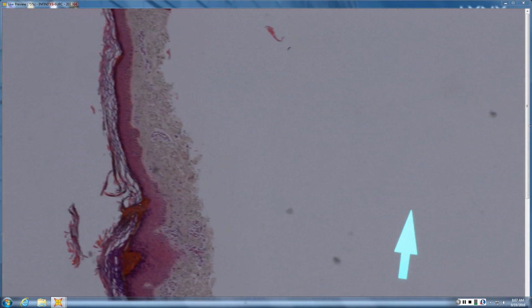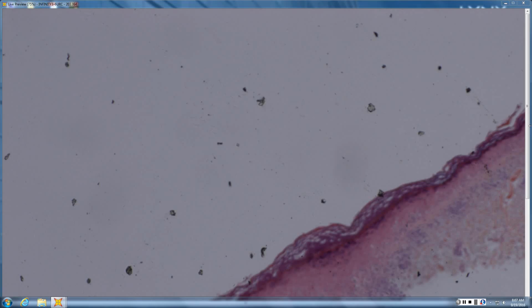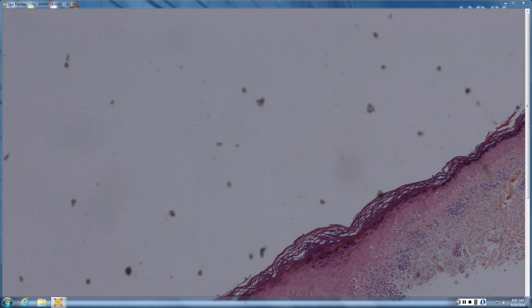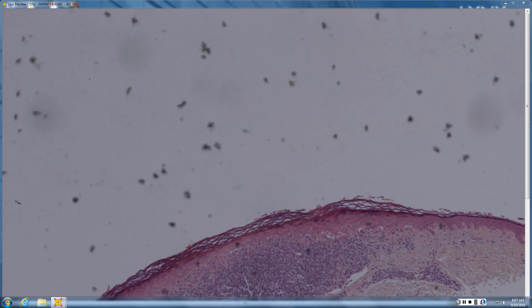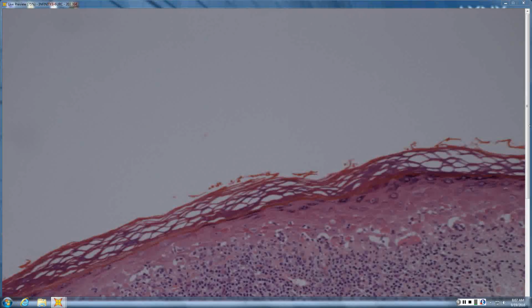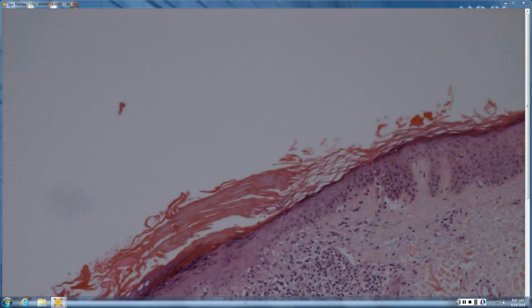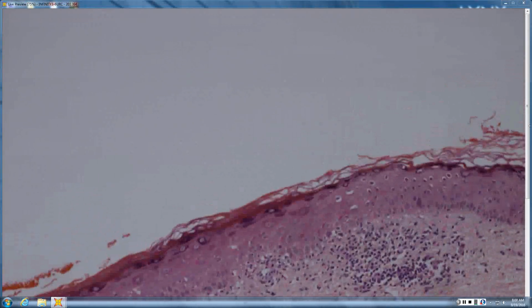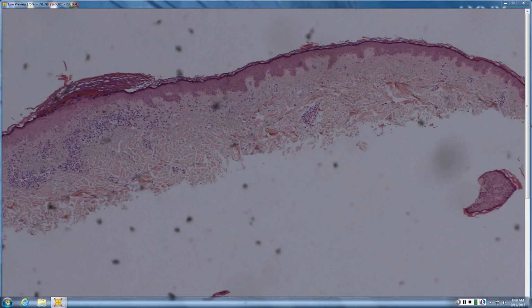Shape here. Is that cornoid lamella? Yes, indeed, it's a cornoid lamella. Very good. So usually with a lichenoid interface, I can see all kinds of dead reds from the scan. So lichenoid interface. Pretty broad biopsy. I feel like right now I'm just in the lichenoid differential. Yeah, lichenoid differential, but with a pretty broad biopsy on sun-damaged skin. What might you include? Lichenoid MM. So lichenoid regression of MM would definitely be in your differential for this one.